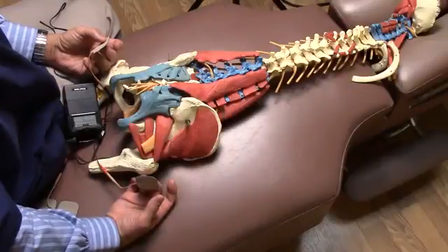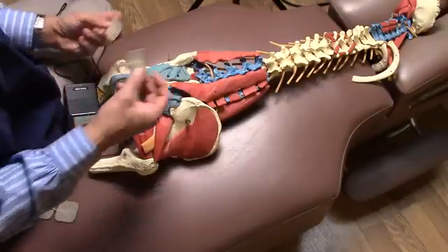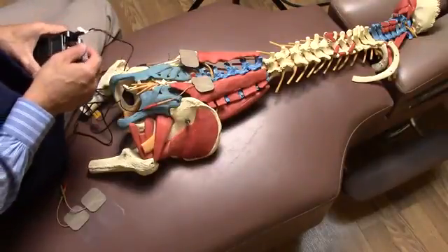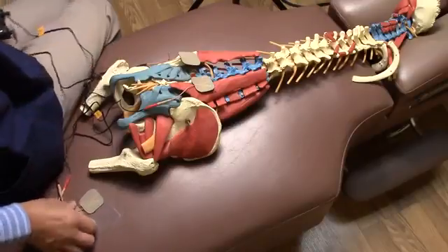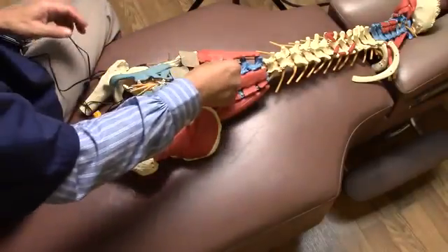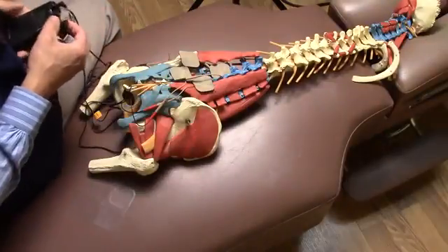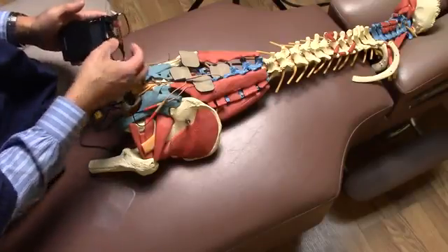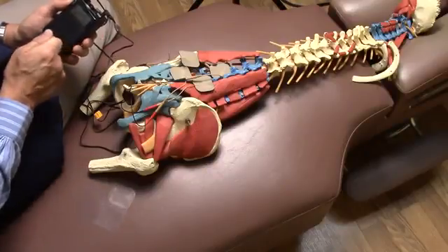If you know you have a bulging disc, a herniated disc in your lumbar spine, and you know the side of where it's bulging to, you can try to put electrodes on either side of that area. Turn it on, try it for a couple of minutes, and see what it does for you. Optionally, you could take the other set on the channel and put it above and below so that you've got a cross that goes over the painful area. And remember, since you have the 4 electrodes, you have to use both channels. So turn it on, see what it feels like, evaluate it after a couple of minutes, and make necessary adjustments.